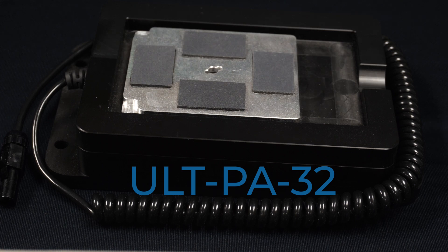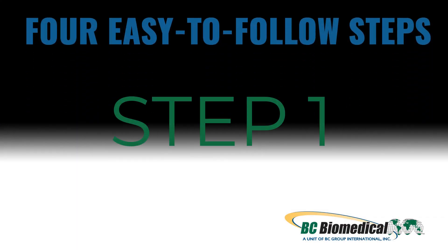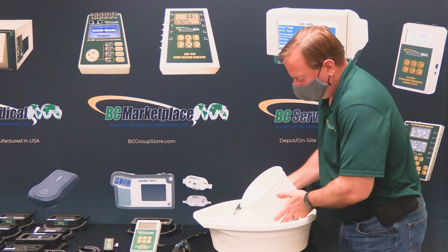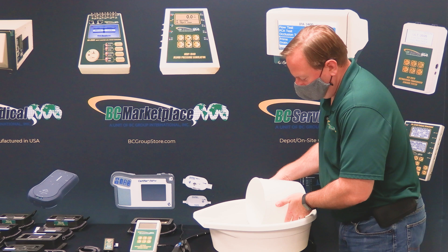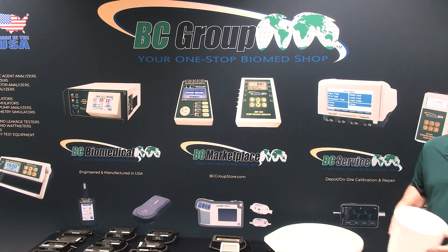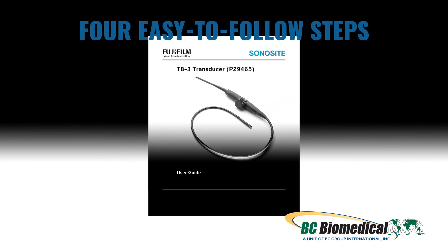We have divided this demonstration into four easy to follow steps. Step 1: Fill your soak tray. When you fill your soak tray use the same cleaning agent for cleaning the ultrasound probe. For recommended cleaners refer to the Sonosight care card.